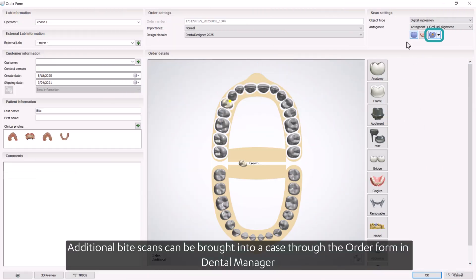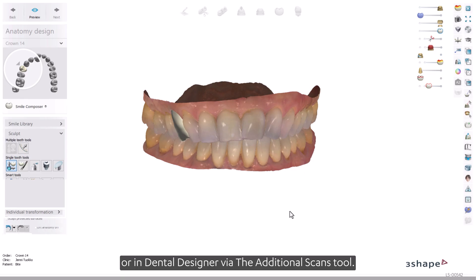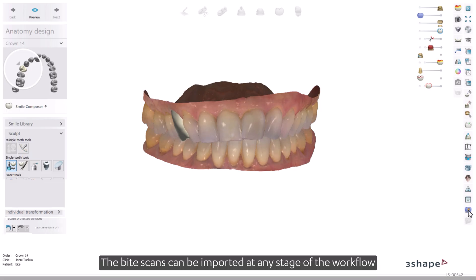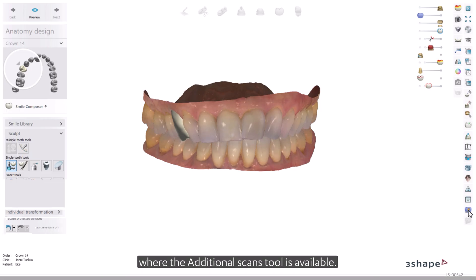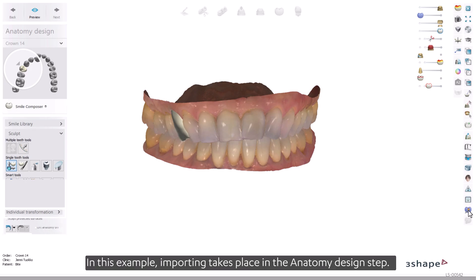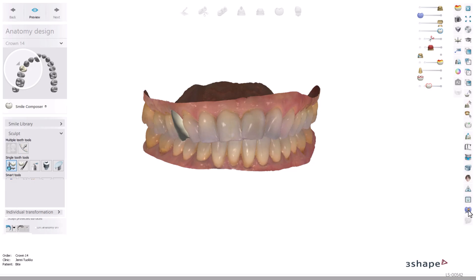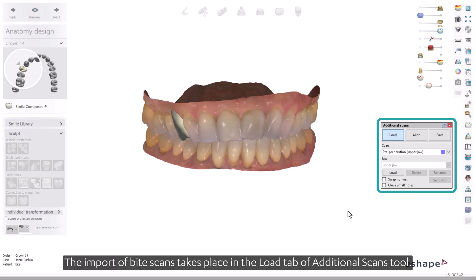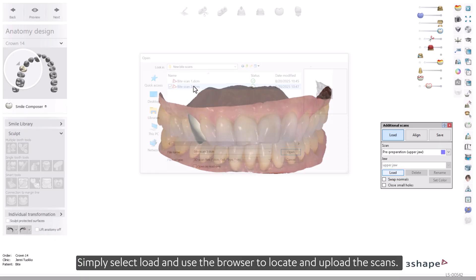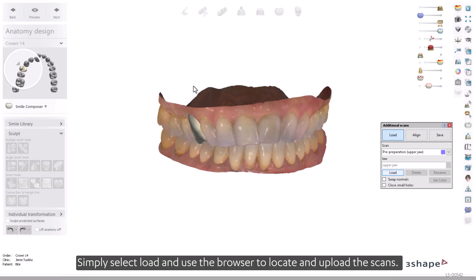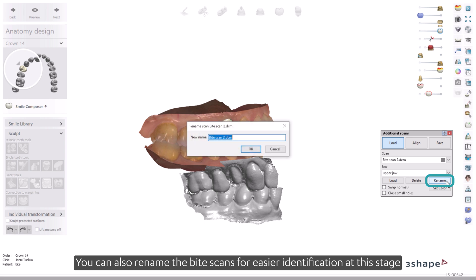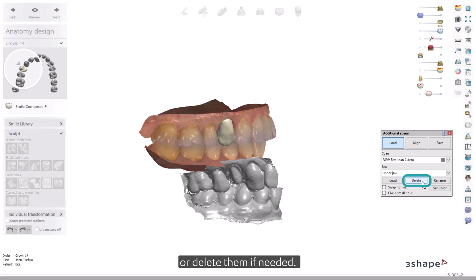Additional bite scans can be brought into a case through the order form in Dental Manager or in Dental Designer via the Additional Scans tool. The bite scans can be imported at any stage of the workflow where the Additional Scans tool is available. In this example, importing takes place in the Anatomy Design step. The import of bite scans takes place in the Load tab of the Additional Scans tool. Simply select Load and use the browser to locate and upload the scans. You can also rename the bite scans for easier identification, or delete them if needed.